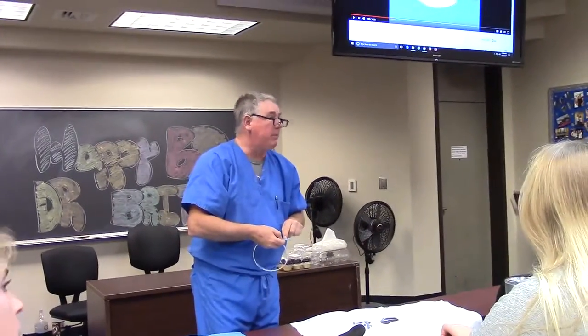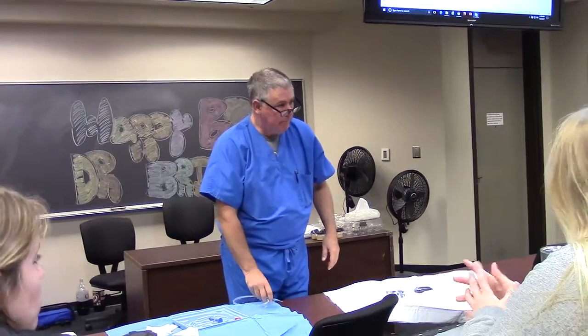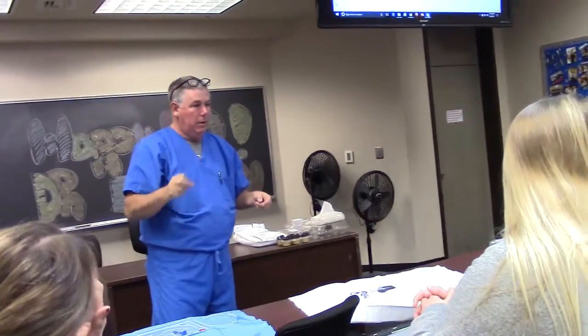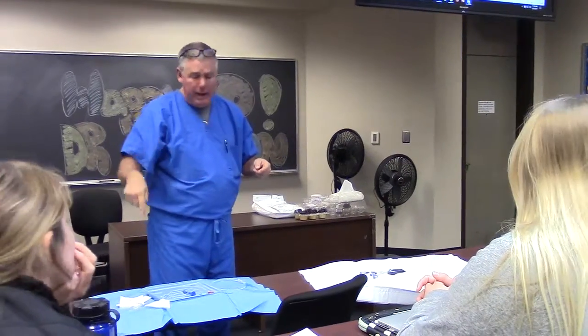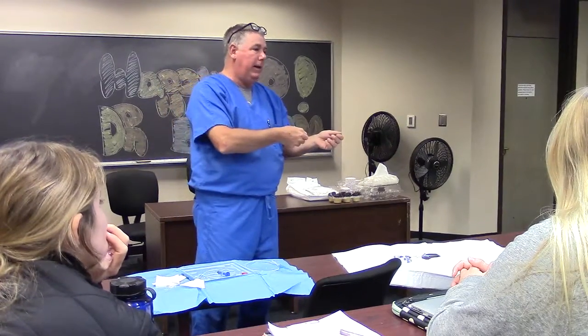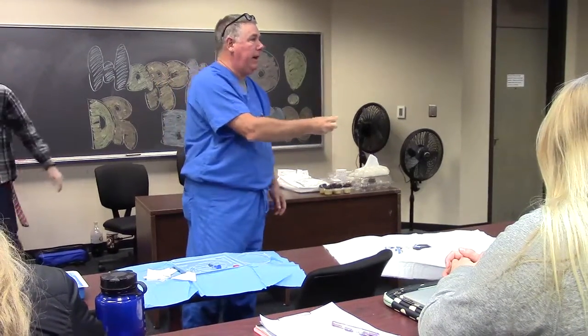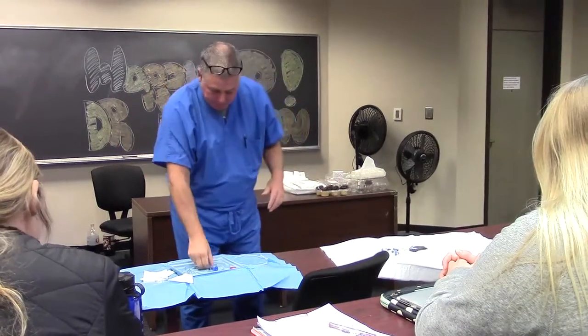Okay. Yeah. Casey. So your syringe, when you first stick, because I know sometimes if you're just doing venipunctures, you can pull your syringe out and it'll fill without having to draw back once you get your flash. Is that appropriate or inappropriate for this? It will not fill automatically. You have to pull back on the plunger. You mean with the lidocaine or with the introducer needle? With the introducer needle. As you get it into the skin, then as you're advancing it, pull back. You always pull back on a plunger as you advance it, and as you advance the needle, and as you retract the needle.